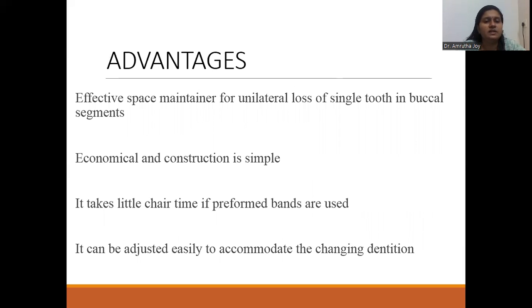Advantages: it's an effective space maintainer for unilateral loss of a single tooth in buccal segments. It's economical and of simple construction. It takes less chairside time if we are using preformed bands and preformed loops. It can be adjusted easily to accommodate the changes in developing dentition.